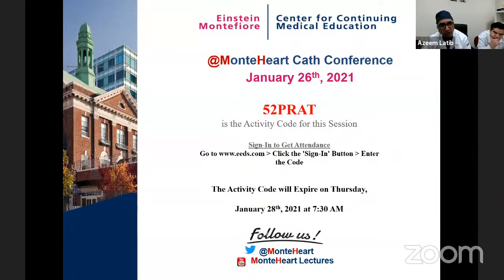So, complex coronary, let's just clarify, Antonio. So, a very calcified, difficult left main where support's going to be an issue, tortuous RCA maybe where you think you'll need a lot of support, maybe a CTO, a difficult CTO.